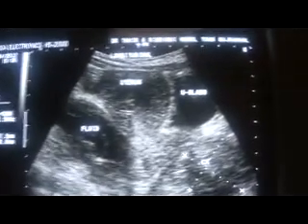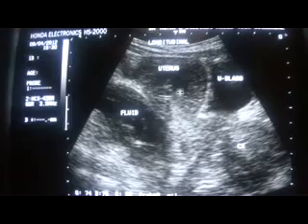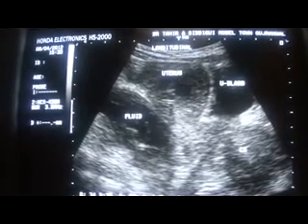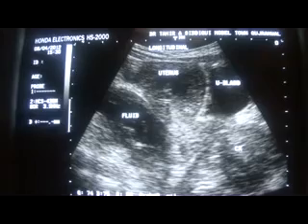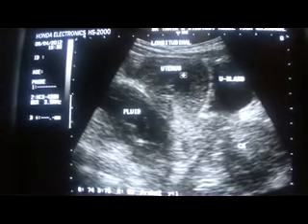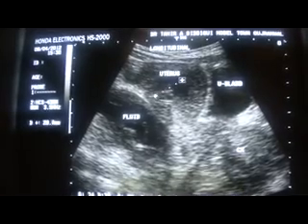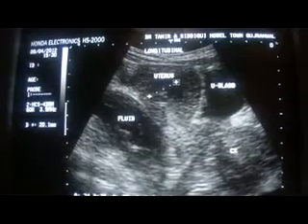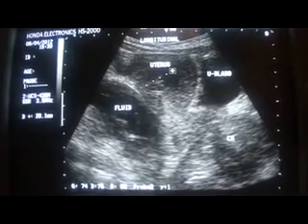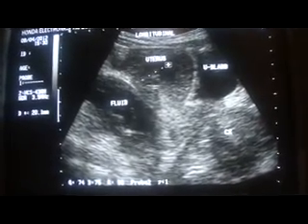And the PUO that she is suffering from is because of this fluid that is collected within the pelvic cavity, and when the fluid contains such echogenicities that you are seeing, it means that the fluid is infected.